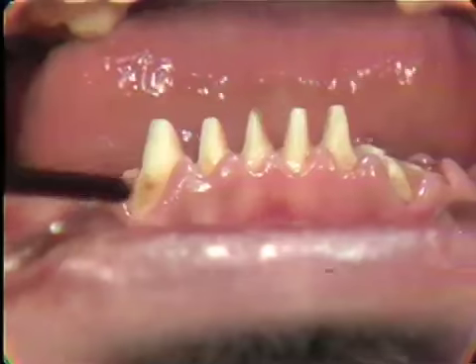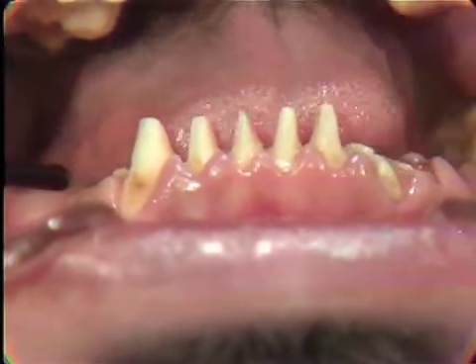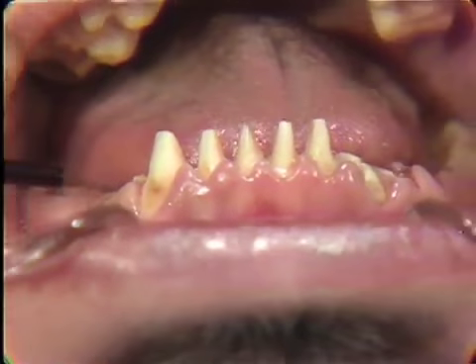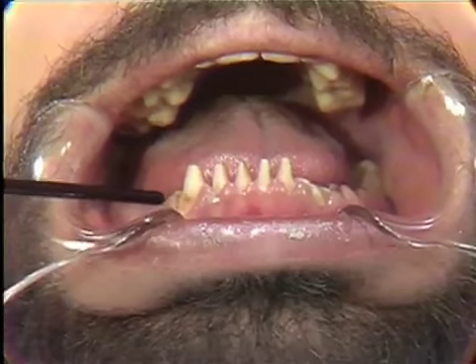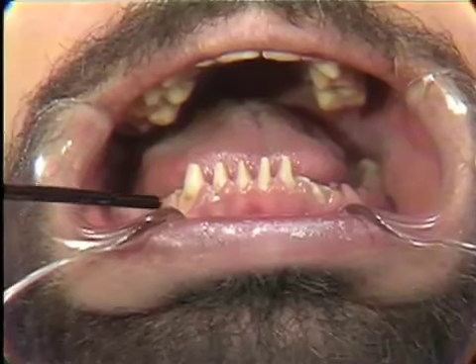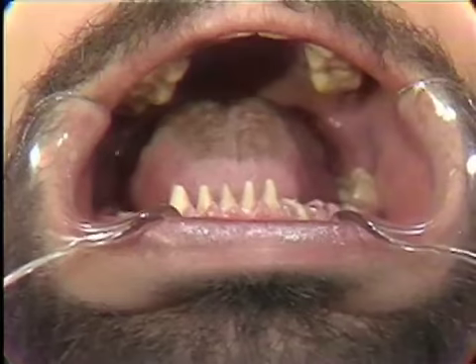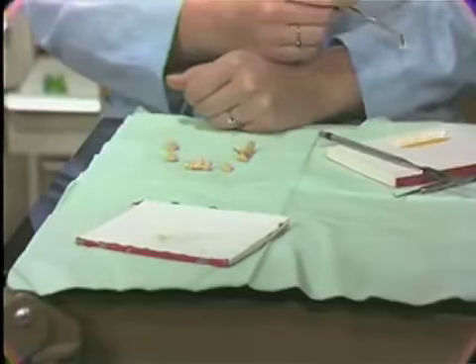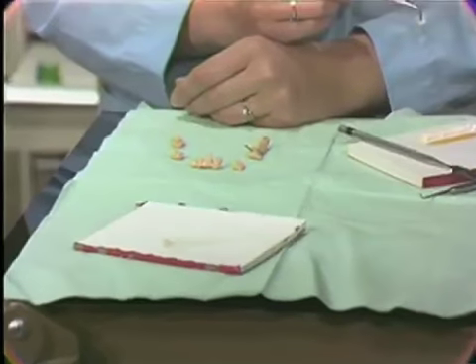So for the cementation of the temporaries, we would like to get the temporary cemented in place with enough temporary material to hold it in place, and yet be able to clean off the temporary material away from the gingival tissue and create a good environment for the tissue. Now the temporaries, in re-cementing them or cementing them in place, should be organized in a logical fashion. So get the temporaries out and line them up the way that they should go in the mouth.